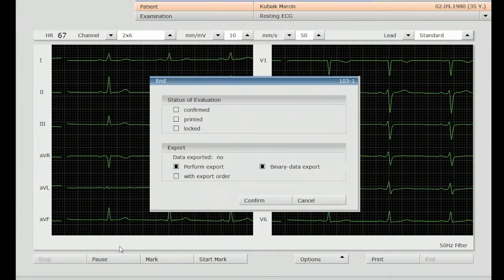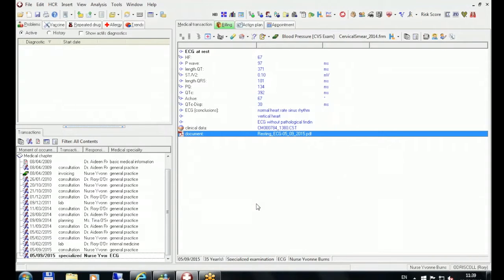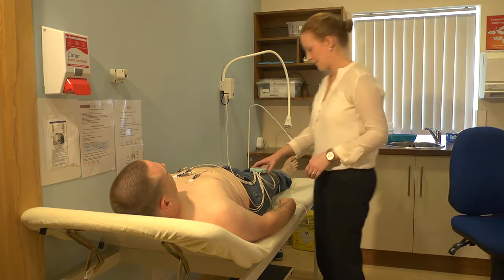She now presses confirm and that's all she has to do — everything else is done automatically. With just two or three button clicks, you have the full ECG recorded in the patient file.